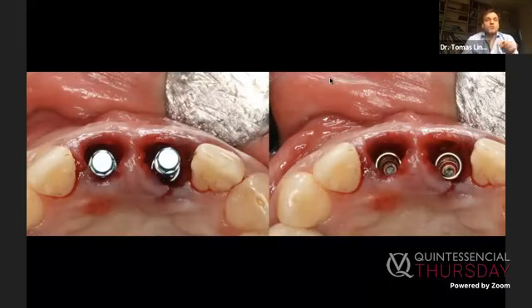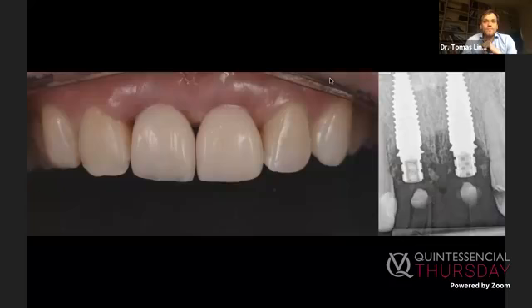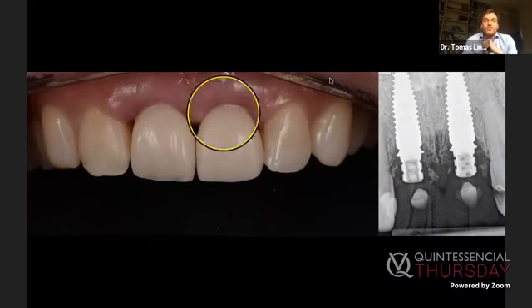And here I'd like to differentiate between two topics. One is if it's an immediately placed implant and the other if it's a healed implant. Because if it's immediately placed, we must prepare our provisional restorations to have this kind of shape, not to have additional pressure on the tissues, just to support them. No pressure is needed, because then you can really cause recession and end up with problems. Here you can see screw-attached provisional restorations on the implants after the surgery.